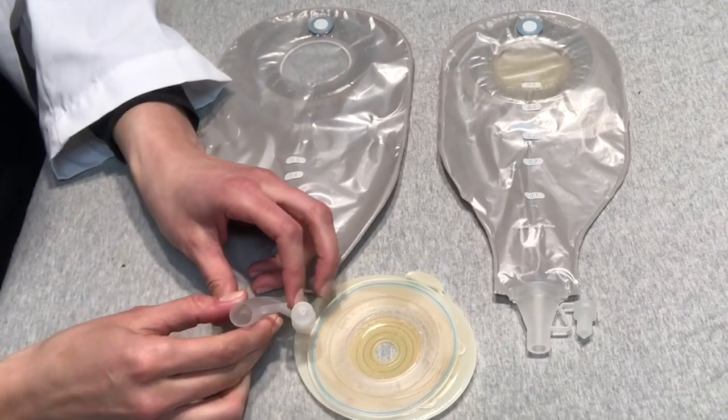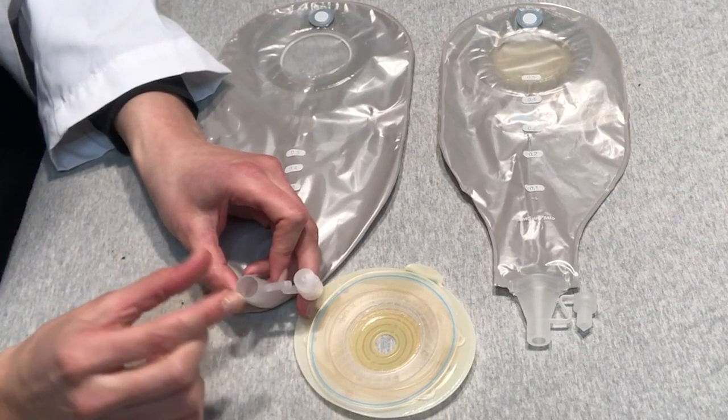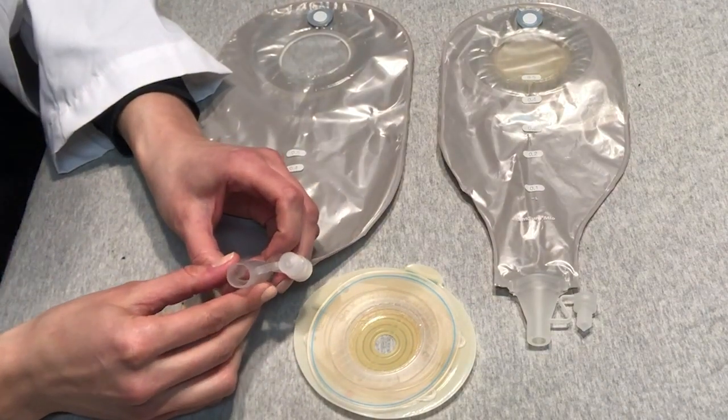This particular outlet is called a tap outlet. The tap outlet is a little bit wider. This helps with emptying thicker high output stool.